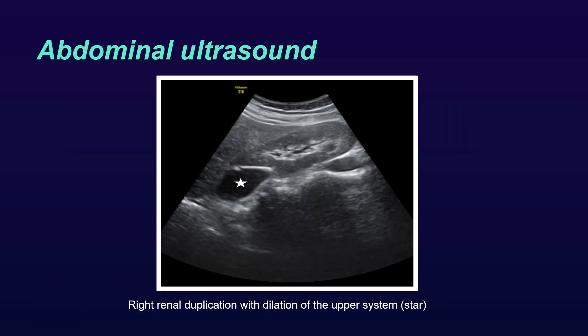Abdominal ultrasound is performed showing a right renal duplication with dilation of the upper system, marked with a star.